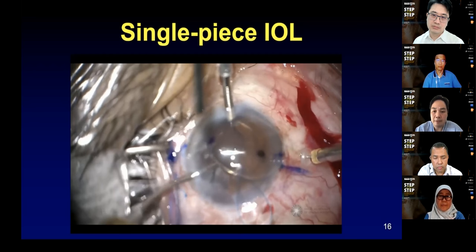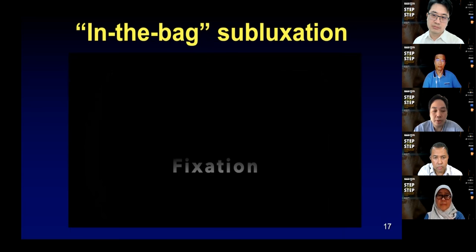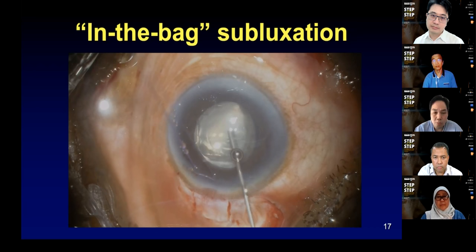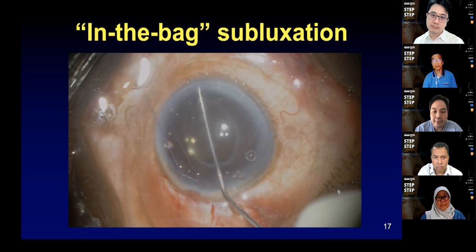So now this is a couple of cases that I'm going to show, which I have done. My experience is still early with this because over the last, I would say a year, I've done several. And these are some of the cases that I'll be able to highlight some points. So in this case, I'm using it to fixate a haptic of a patient with pseudoexfoliation. So this patient has got pseudoexfoliation and glaucoma. So my colleague has done the trabeculectomy here and has created a scleral flap. And I'm coming in to fixate the lens.